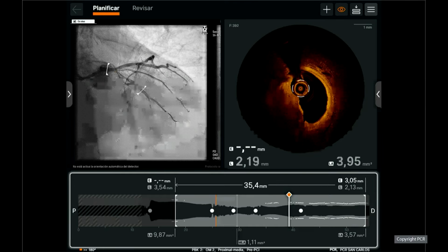And this is the distal landing we have decided. For the left main, we thought it was really not needed to go to the very ostial part of the left main, that we could keep it maybe in the mid part of the left main, so an area around here, for example. So probably the idea is to cover this with a 3.0 by 33 millimeter stent.